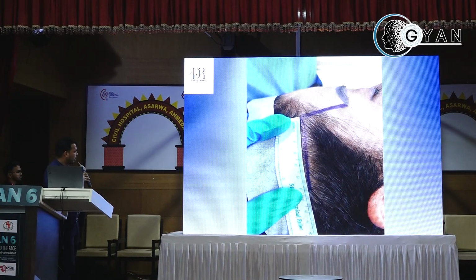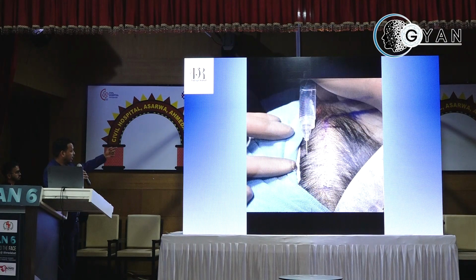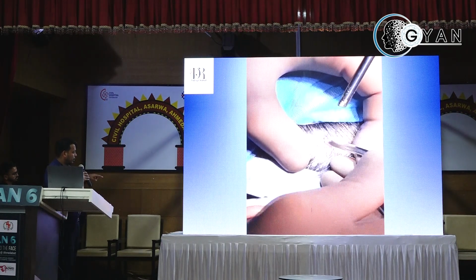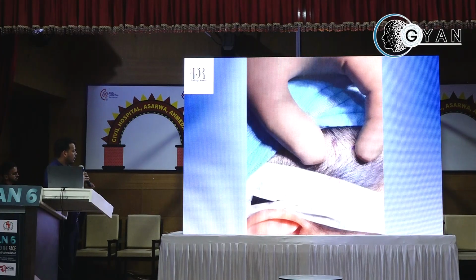This is a normal marking for normal temporalis fascia harvest, and these are the 2 incisions, the anterior and the posterior, medial and lateral. After that, we have given the tumescent agent. It's like the fascia lata harvest technique, where with minimal 2 or 3 incisions you can harvest as much fascia lata as we require. So this is the same technique. This is a small incision.